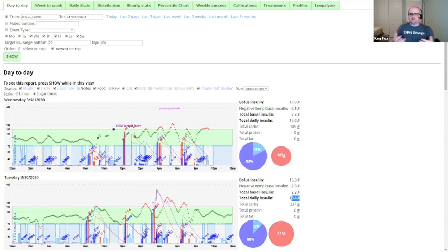So a true basal bolus ratio would be you have your basal rates and they run all day long, and that's a certain amount of insulin, and then you add up all the boluses on top of that, and then that's your basal to bolus ratio. But Loop is just giving you more and less insulin, and it's either using temporary basal rate functions or small boluses in the case of autobolus to get you the insulin you need or to turn off the basal rate to take away insulin you don't need. So basal bolus ratios are even more useless with Loop, right?